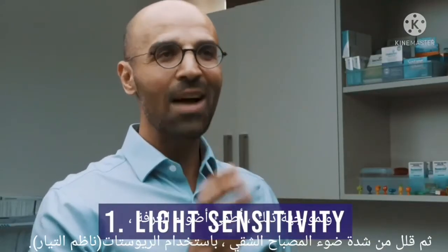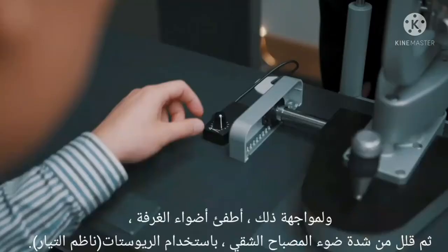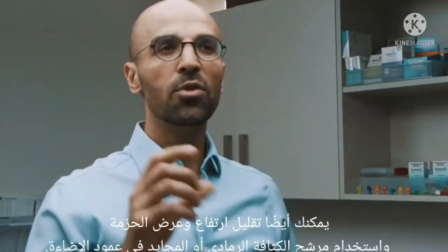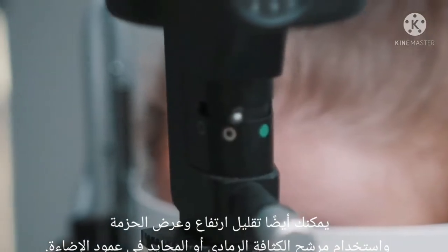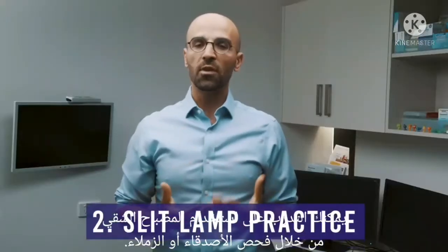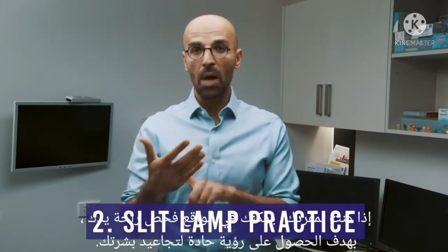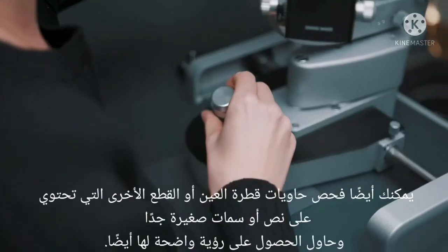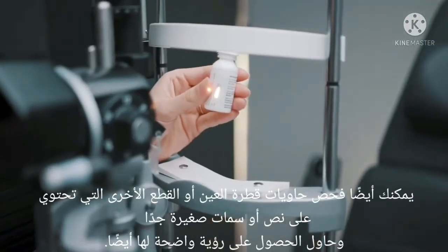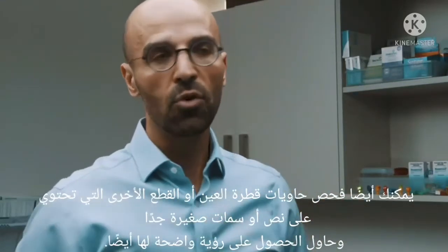Firstly, a common problem is patients being light sensitive. So to counter this, turn the room lights down, then reduce the light intensity of the slit lamp using the rheostat. You can also reduce the height and width of the beam and use the grey or neutral density filter on the illumination column. You can practice using the slit lamp by examining friends or colleagues. If you're on your own, you can actually examine the palm of your own hand, aiming to get a sharp view of your skin creases. You can also examine eye drop containers or other items which contain very small text or features and try to get a sharp view of these as well.